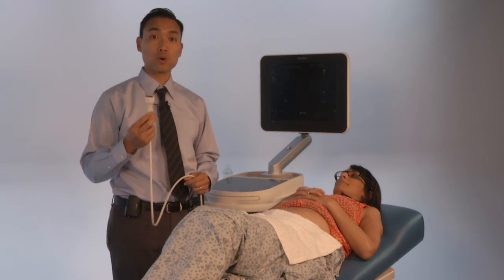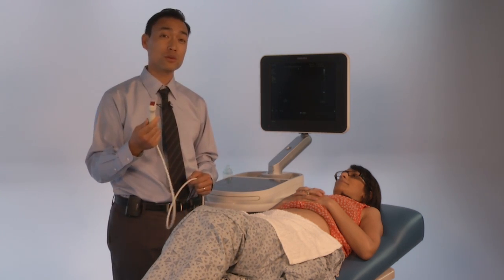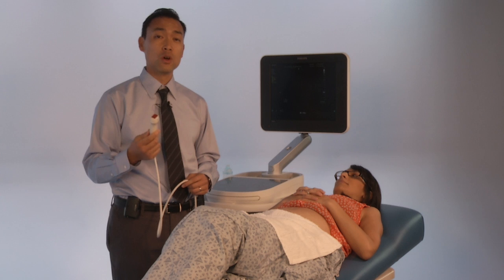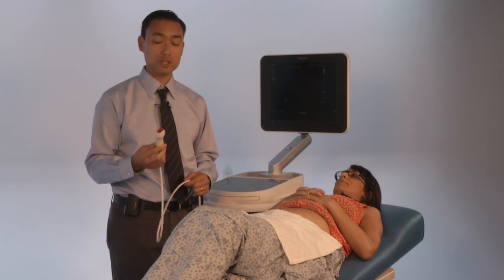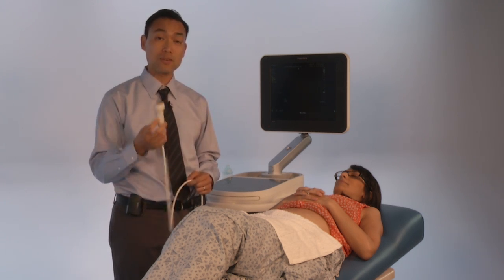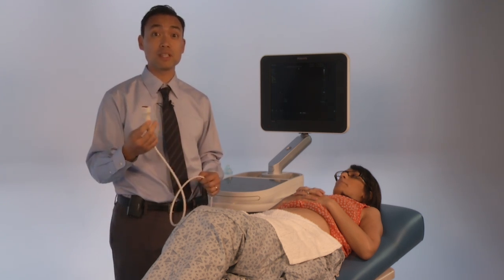The ultrasound probe you want to use is either a phased array transducer or, even better, a curvilinear transducer. Today we have a phased array transducer, which is completely adequate.